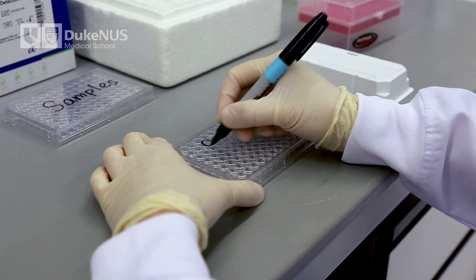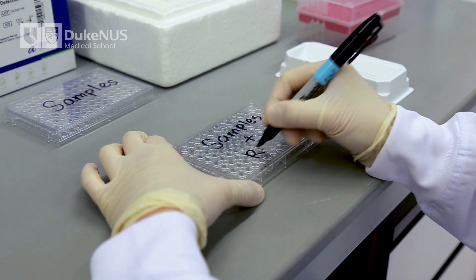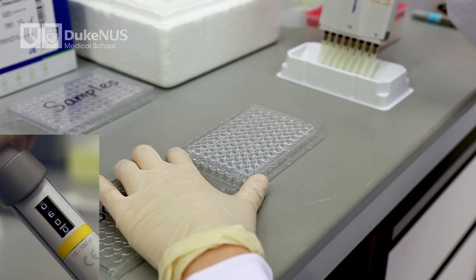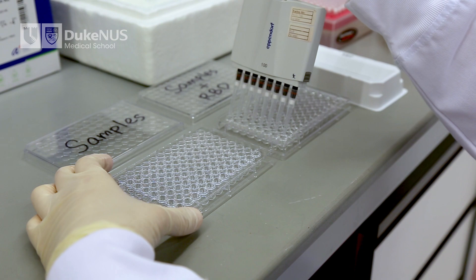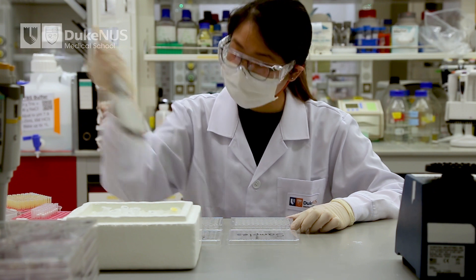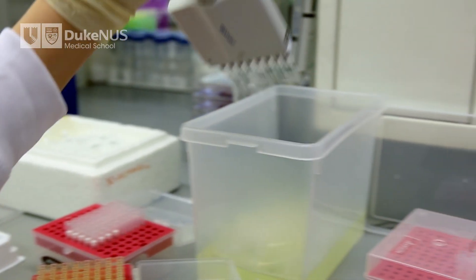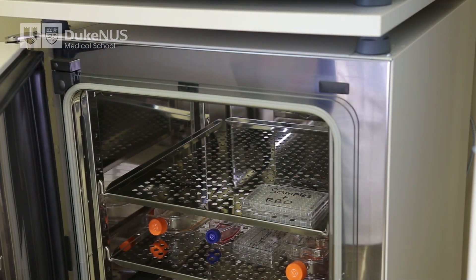In separate tubes, mix the positive and negative controls and the samples with the HRP-conjugated RBD. We recommend using 60 microliters of samples mixed with 60 microliters of the HRP-conjugated RBD. You can also do this on a clean 96-well plate as shown in this video. The use of disposable filter tips is optional. Used tips should be discarded into freshly prepared 10% bleach solution. Incubate the mixture at 37 degrees Celsius for 30 minutes.